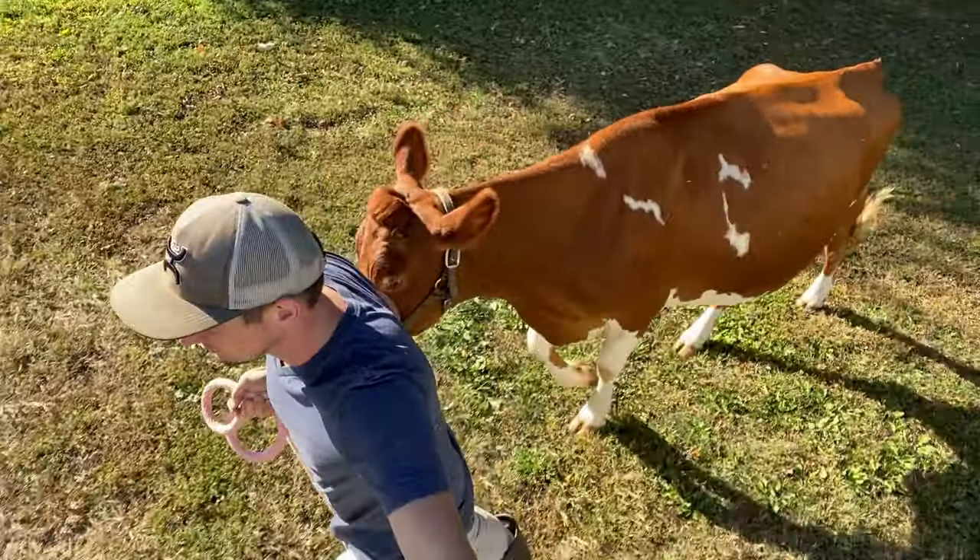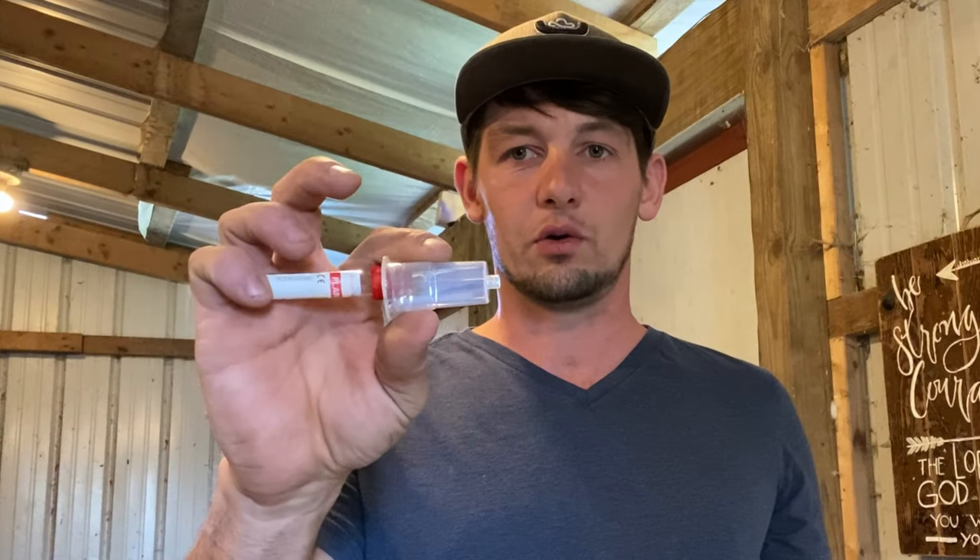So I'm going to go ahead and pull this sample, do the pregnancy test, and I'm going to show you how to do it too. What we're going to need to do it is a needle, a vacutainer, and a needle holder.